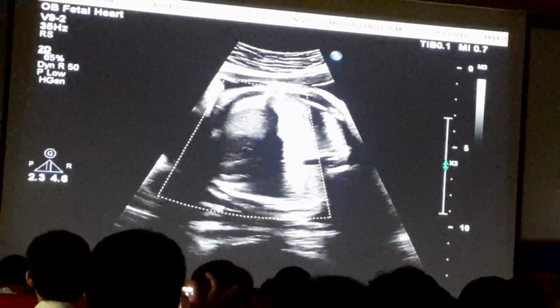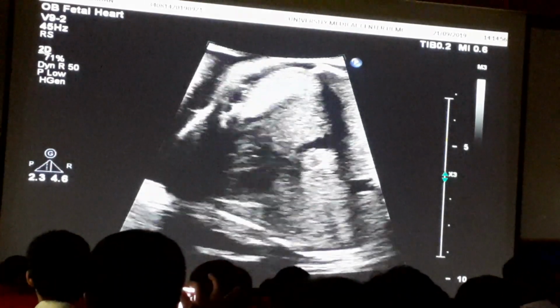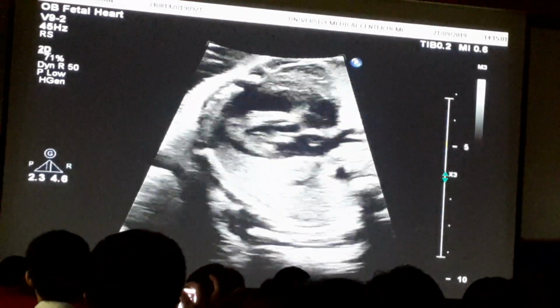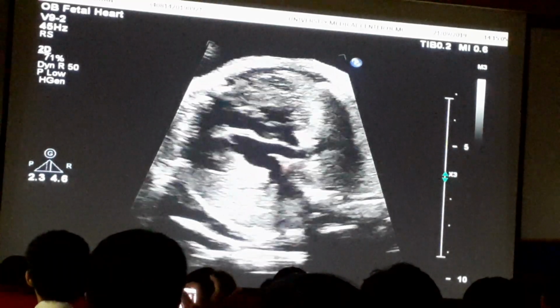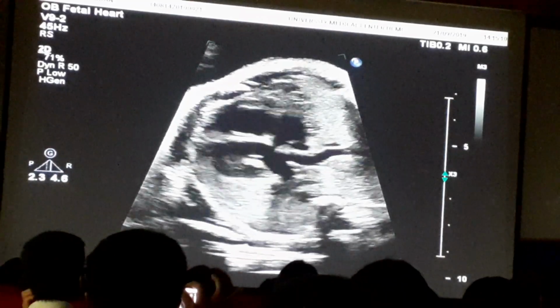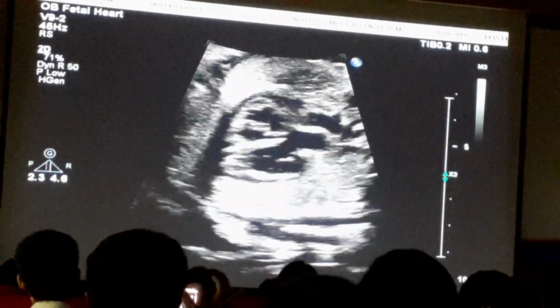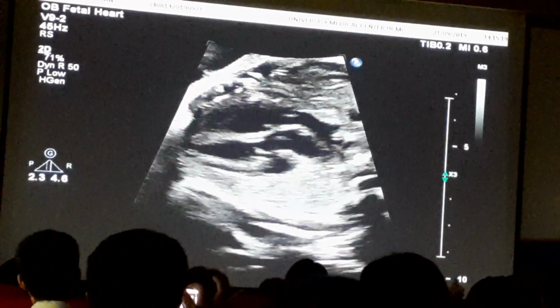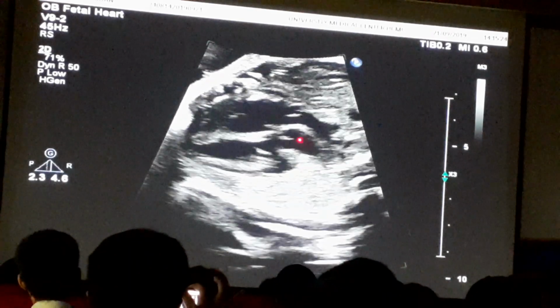I'm going to make it better for you. Okay, so there's four chamber, outflow tract, 4 buồng đường thoát. Bifurcating, two parallel great vessels. Hai cái động mạch song song và cái động mạch phía sau đó nó chia đôi ra luôn. See there? Đây là cái động mạch phía trước, động mạch phía sau có nhánh.